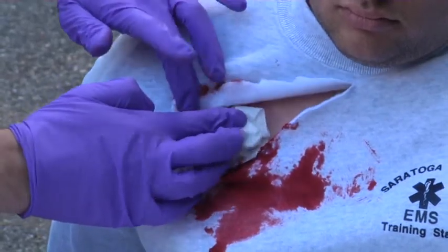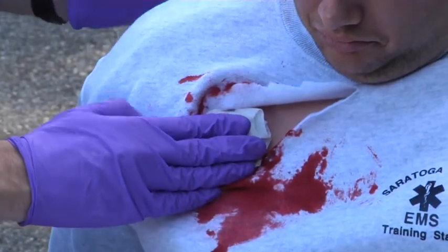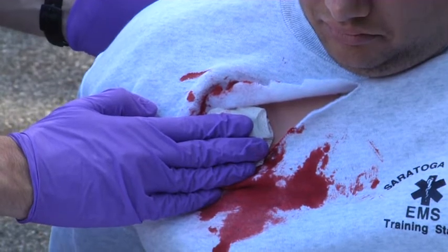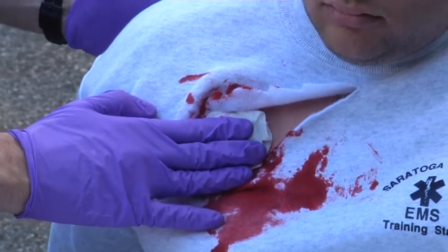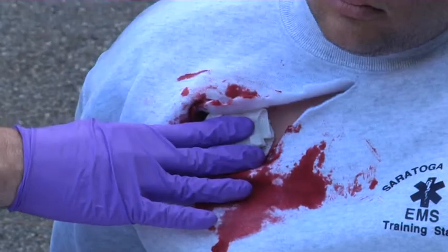After about five minutes of pressure, if you find that the Combat Gauze has soaked through, you can add additional Combat Gauze on top of it, just as you would with any other dressing to control bleeding. After you've controlled the bleeding and you're certain that there's no further bleeding coming from the wound exteriorly, you would use a dressing to secure that in place.